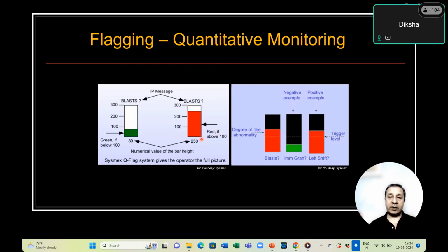have the concept of looking at blasts and defining at what percentage you are going to classify something as blasts. So here, the threshold has been put at 100. Anything less than 100 will not be identified as blast, whereas anything beyond 100 will definitely be identified as blast. What is also important to realize is that while the percentage may not be exact or truthful, you also need to remember that you will be able to quantify in certain cases.